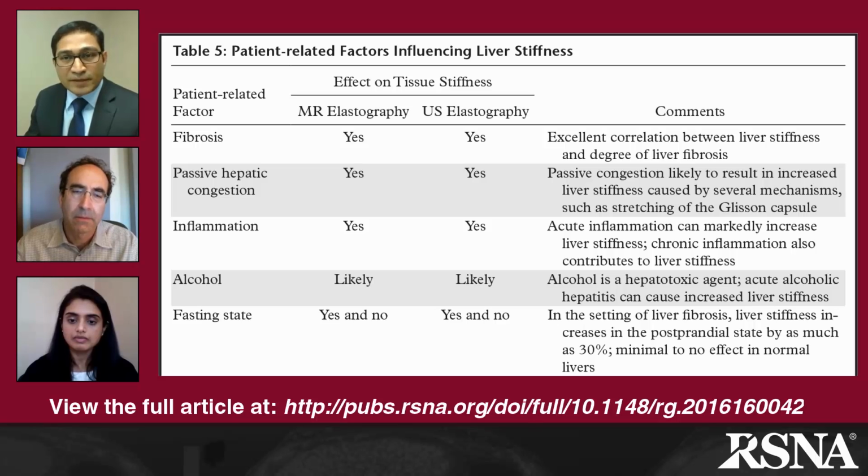On the same line, acute alcoholic hepatitis, like when somebody goes on an acute binge of alcohol, can also cause severe inflammation of the liver, and at that time liver stiffness can be higher. So we need to take into consideration whether the patient has these coexisting confounding factors before using any elastography technique, whether MR or ultrasound, because these are going to give you falsely elevated stiffness and you might interpret it as cirrhosis. So you have to be careful to rule out these conditions.